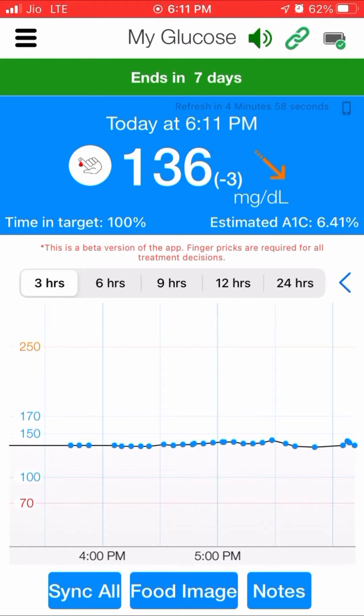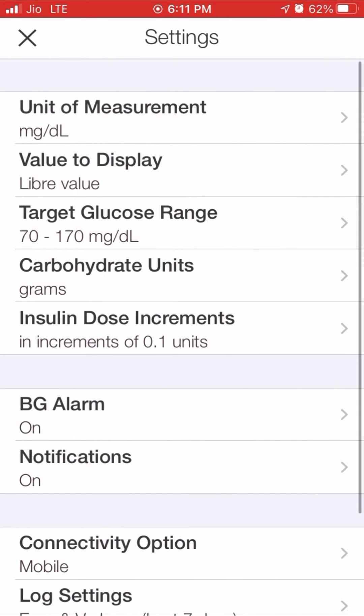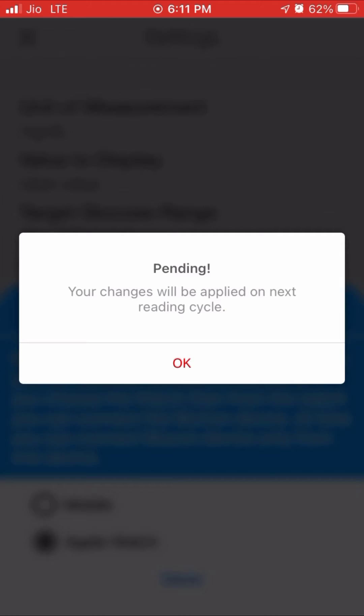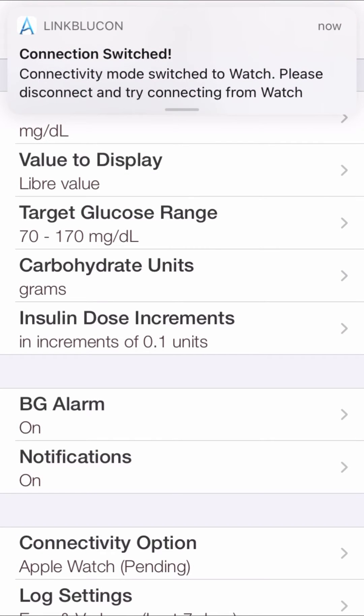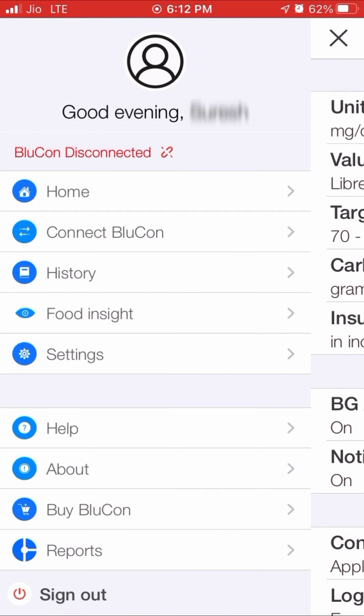Go to the settings of the LinkBluecon app and tap on the connectivity option and select the option Apple Watch. This will automatically disconnect the Bluecon from the phone and connect to Apple Watch without user intervention. If it doesn't connect, open the LinkBluecon app on your watch and follow the same steps to connect the Bluecon to the watch.